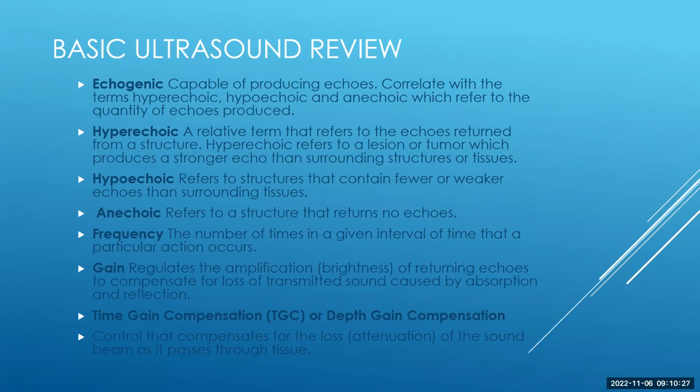That's going to allow us to have a very high resolution, very robust image. If a high frequency is used for structures that are deep, let's say 5 to 6 centimeters or more, 10 centimeters, like with certain abdominal or chest ultrasounds, we would lose resolution and you'd have a lot of scatter, and it would be a very poor quality ultrasound.